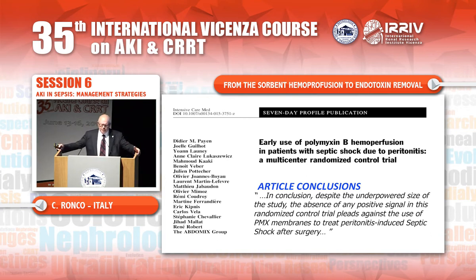I must also acknowledge that we had some conflicting results, and these are the results from Didier Payen in a study where he concluded no difference in patients treated with or without the PMX system. However, one of the interesting things about this study was that the mortality of the control group was less than 20%. So these are not the typical patients that we characterize as severe patients. If the mortality is 15% in the control group, how can we further improve mortality? These patients simply don't die. So it's a very strange population that was studied. Plus, almost 40% of the per protocol patients enrolled did not receive a complete therapy, so they were protocol violators.